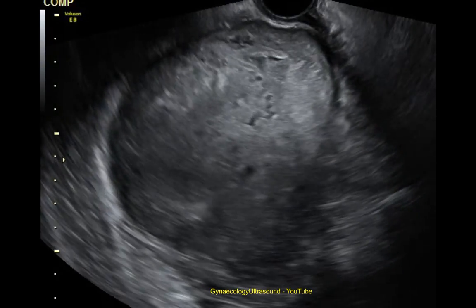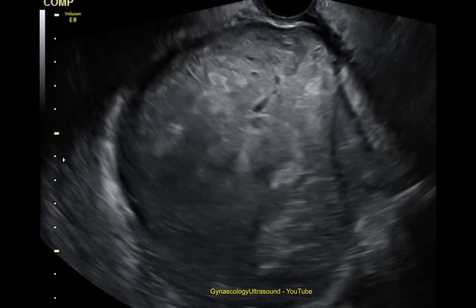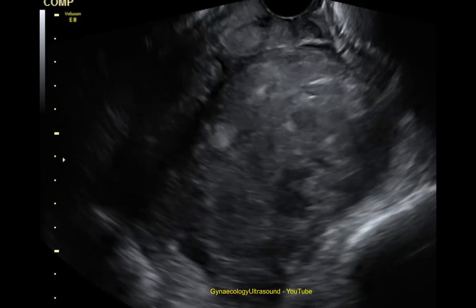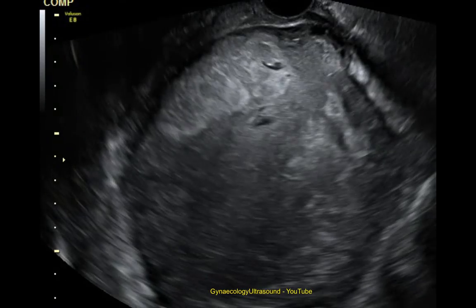This is a video of a mass which is irregular solid. You can see all the internal cystic spaces have an irregular shape. This is irregular solid.